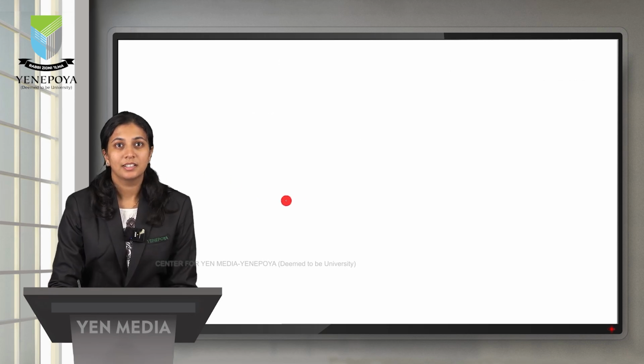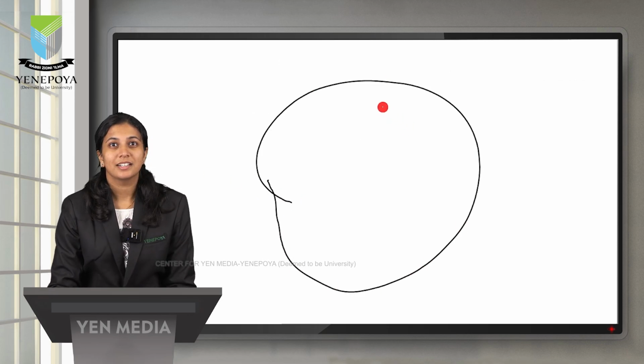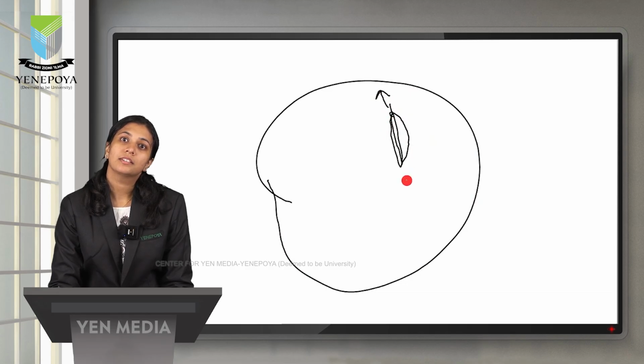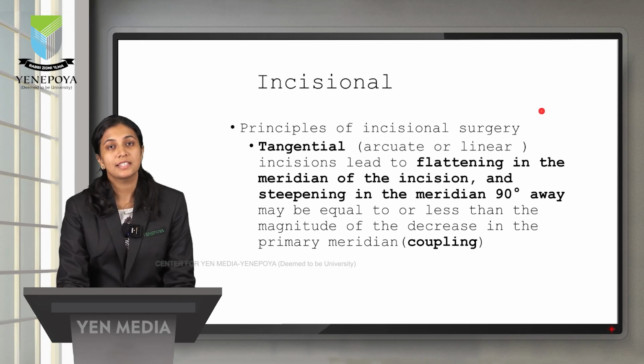Now, imagine this is the cornea and you make an incision here, okay, radial incision. Because of the separation of the fibers here, there will be a flattening in this meridian, that is the meridian of the incision, and flattening 90 degrees away. In tangential incision, there is flattening in the meridian of the incision and steepening 90 degrees away. This is called coupling.